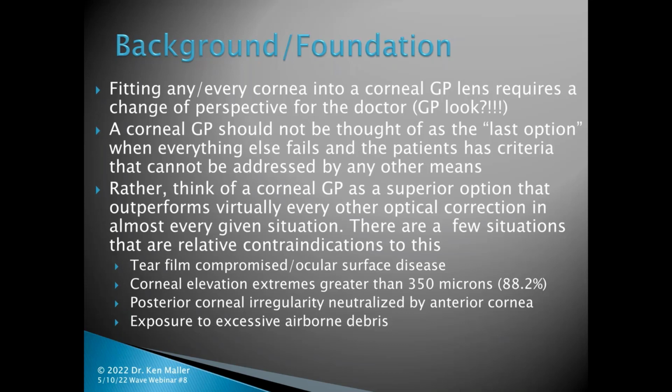Exposure to airborne debris. So if you're thinking about the person who hangs sheetrock all day long, that's a person who's going to have a tough time with a corneal GP because you will be getting a lot of debris underneath that lens. So any place where you have a patient that's exposed to a lot of airborne debris, this is a real tough situation for a corneal GP to perform well in.